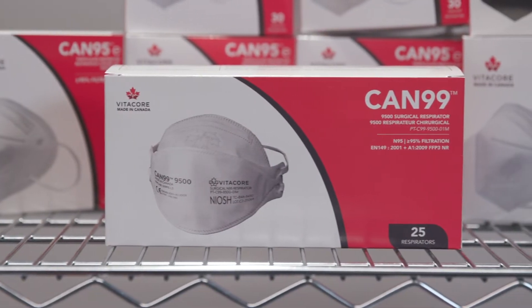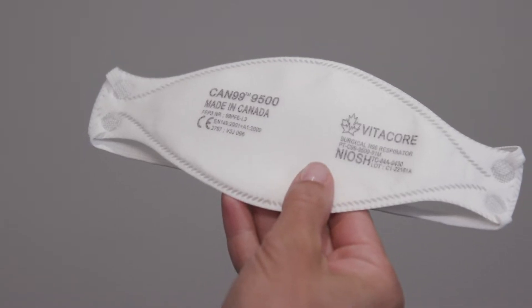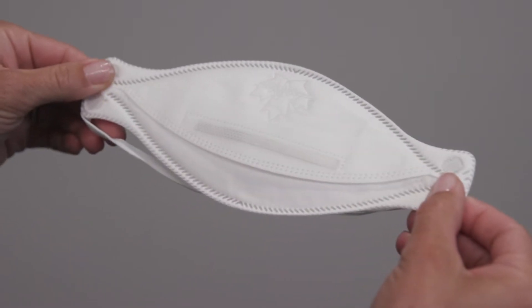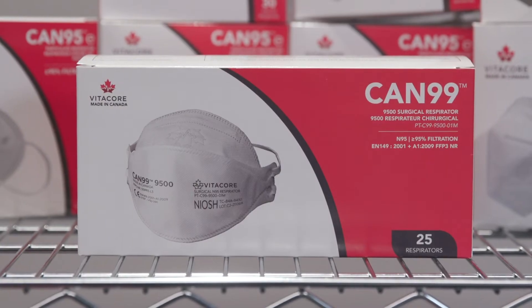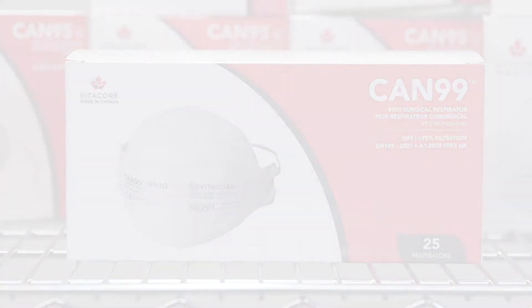The VitaCore CAN99-9500 is a NIOSH, Health Canada, and CE-approved three-fold particulate respirator and surgical mask. Follow these instructions when you don your respirator to ensure you achieve a proper fit.